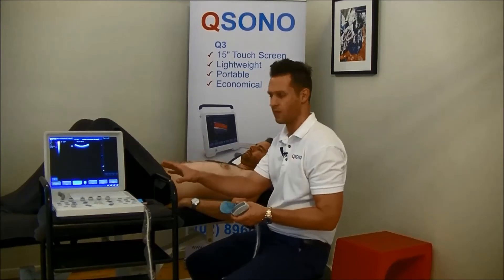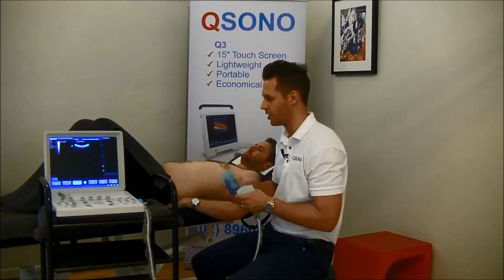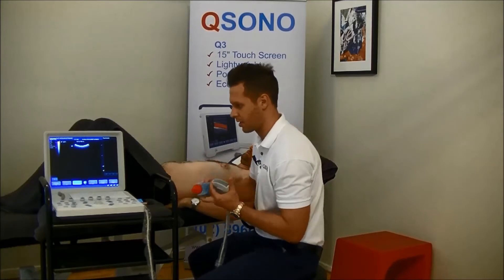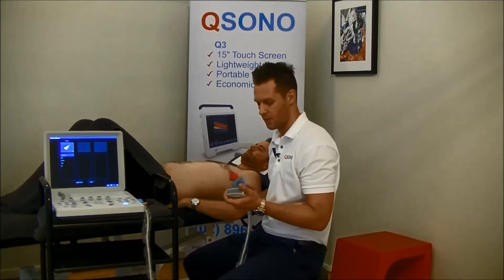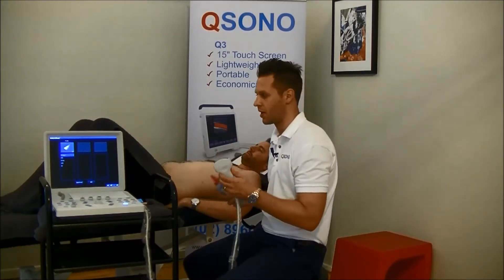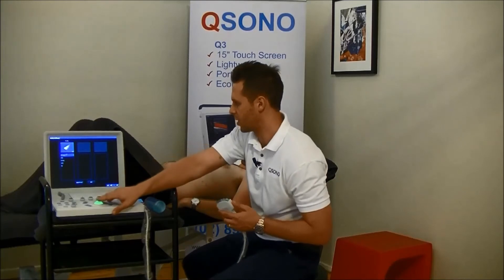Typically we'd have the ultrasound unit facing both the therapist and the patient so that everyone can see. For this video, we're just going to have it facing the camera. Now that I've entered the patient information, we're going to start off by selecting the right probe. You can get a pretty good image using a linear probe for transverse abdominus, but for most patients you're probably better off using a convex probe like this, which has a lower frequency and better penetration. So we're going to choose our preset for abdominal here.